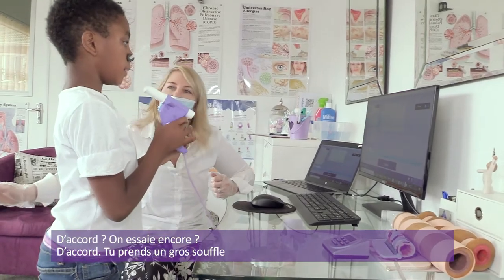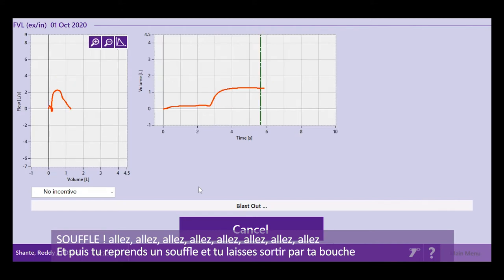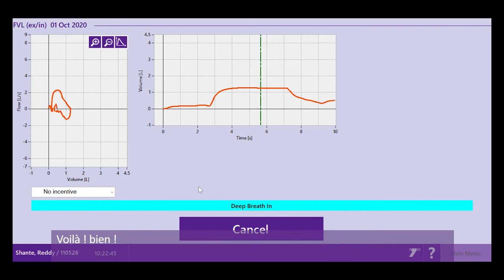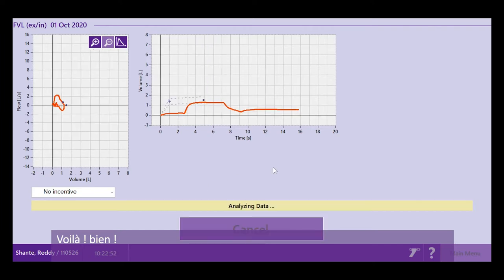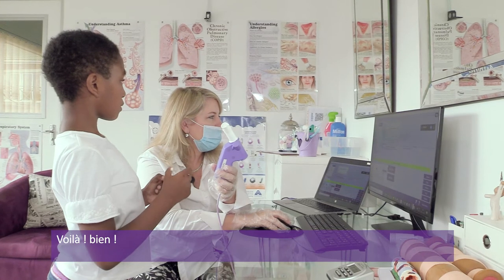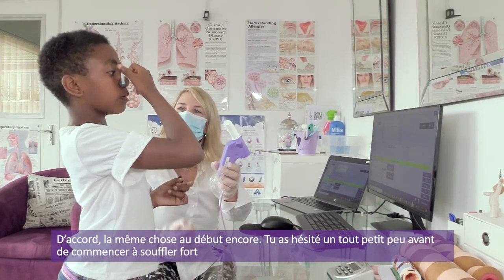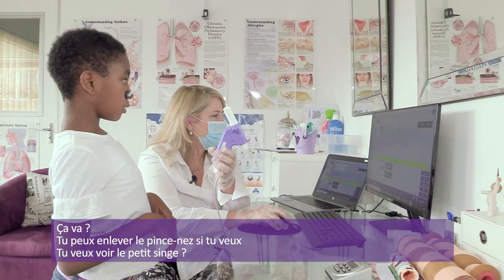Okay, all right. Take a nice deep breath in. Fast as you can, go. And breathe in fast and out your mouth. Out your mouth. There, that's it. Good, well done. Very nice. Okay, the same thing at the top there. There was just a little bit of hesitation before you started to blow. You can take your nose clips off if you want.